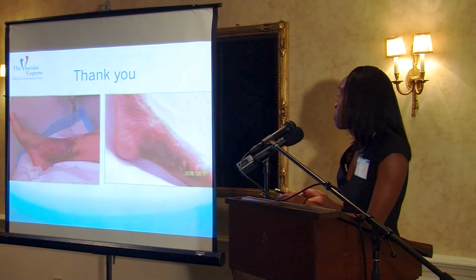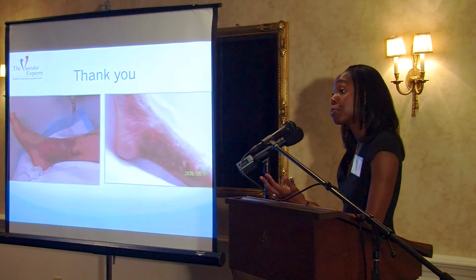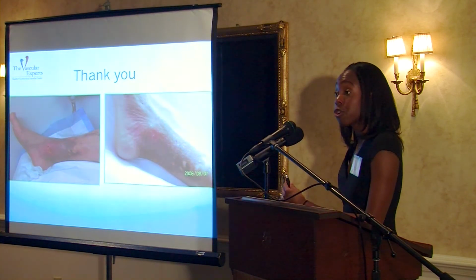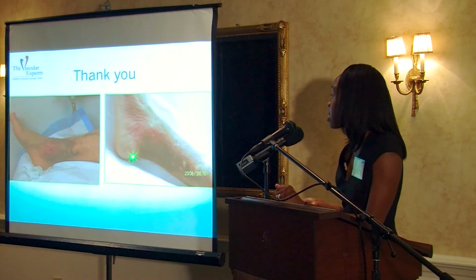So this is, again, just to remind us, varicose veins, of course, come with discomfort. Again, the heaviness, aching, swelling, itching, etc. But as we've talked about earlier, what's most troubling about superficial venous insufficiency is that it leads to chronic ulceration. And this is a patient who had superficial venous insufficiency treated with radiofrequency ablation. This was the ulceration to start, and this is the healing ulceration. And again, more than just bringing that ulcer to heal, it's the prevention of recurrence.